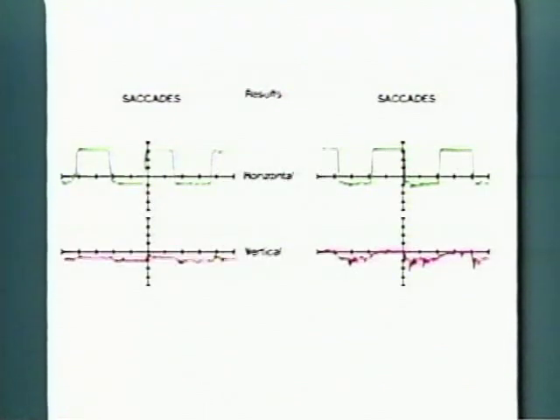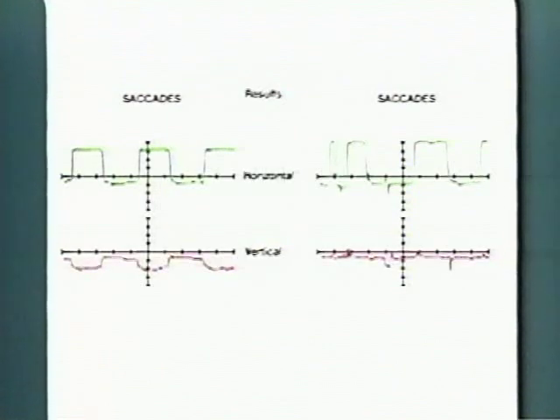And even though there are some mild glissades and perhaps some musculoskeletal movement, the ability of this particular patient to perform the saccade testing is normal. The next two examples constitute overshoots, where we can see that the patient's eyes have overshot the target or actually moved beyond the limits of the computer's ideal target.